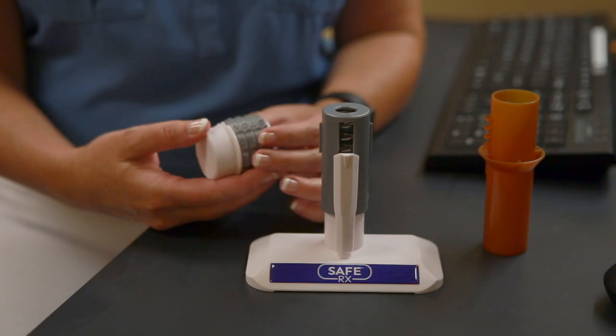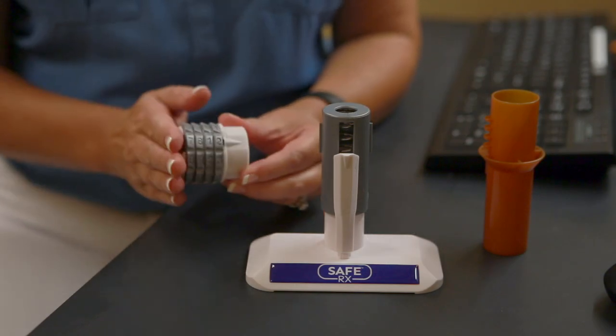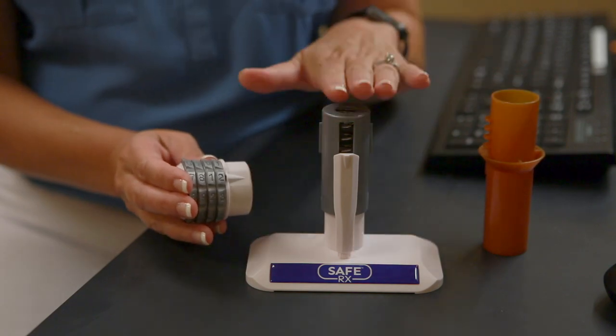Hi, I'm Jennifer and I'm here to teach you how to encode a cap for the SafeRx locking prescription vials. There are three parts to this process: the cap, the vial, and the encoder.